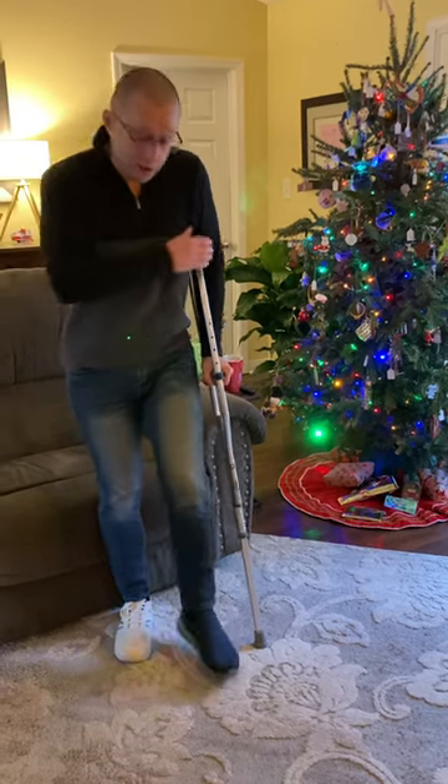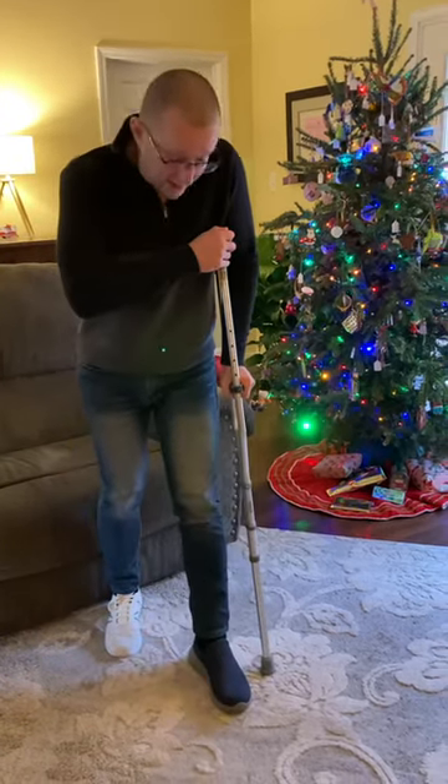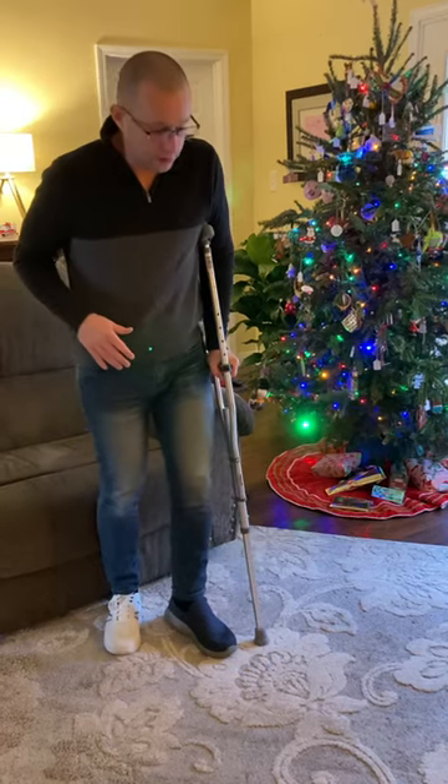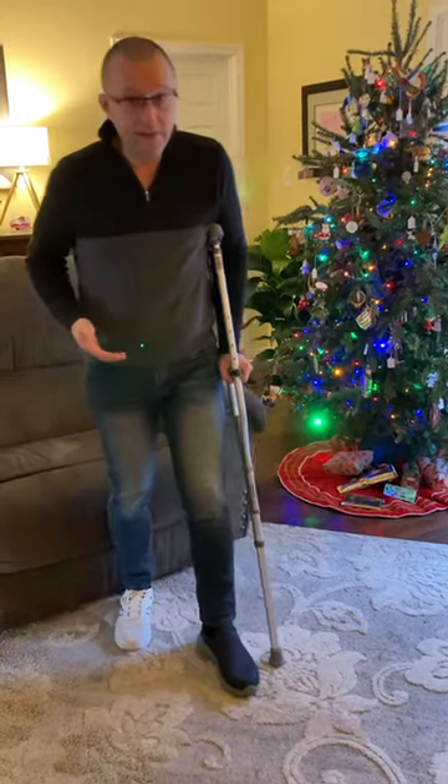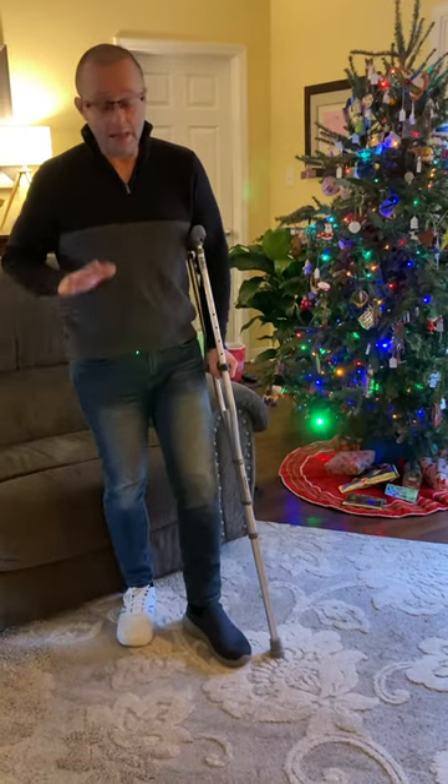I used to think you put it on the same foot and you did this. I'm not going to do that because you actually put a lot more pressure on it. I've seen people with canes do this with the same foot. Maybe that's helpful, maybe it's not — I don't know.